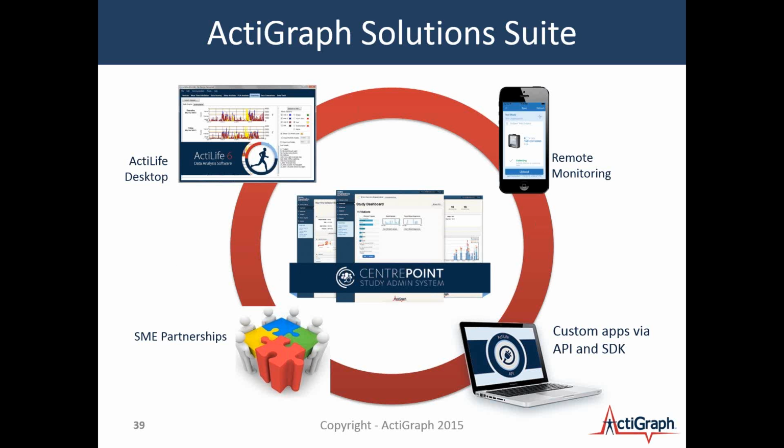Angela asks, do all of your accelerometers work with CentrePoint? For example, ActiSleep, or do you need to purchase new accelerometers? Great question, Angela. All of our monitors do work with the CentrePoint solution. Some of our older monitors, dating back to 2007, will not work with the system. But if you have a device with serial number NEO or later, and you can check the website for that information, it will work with the system. And so anything that we've sold in the past probably 4 to 5 years will work with the CentrePoint system. Thank you for that question.